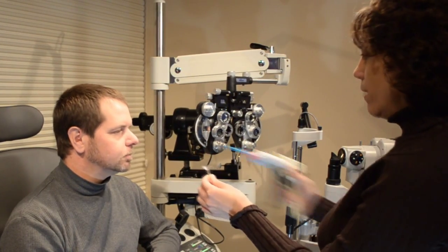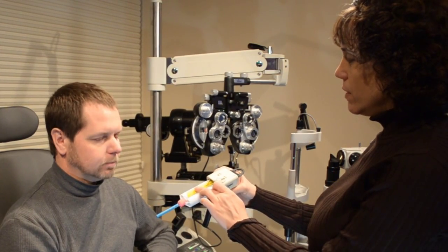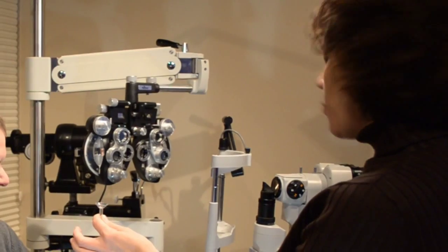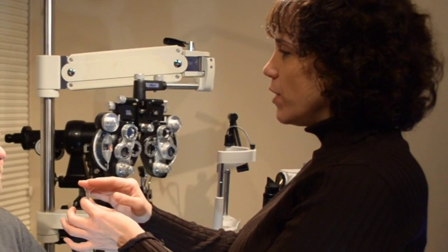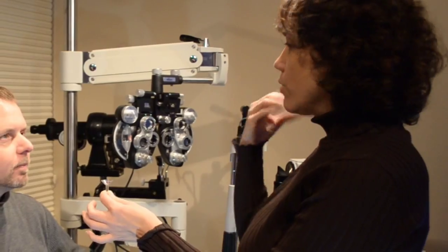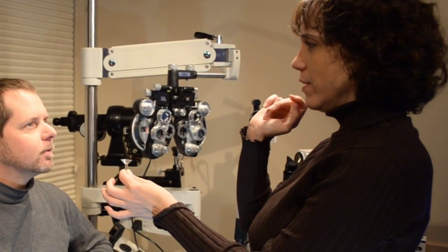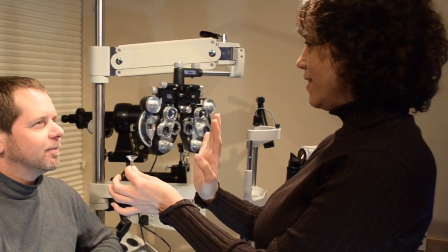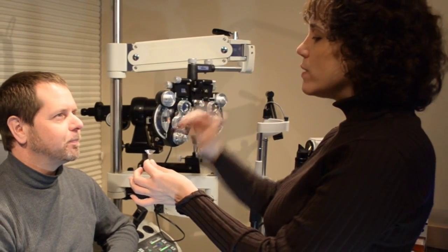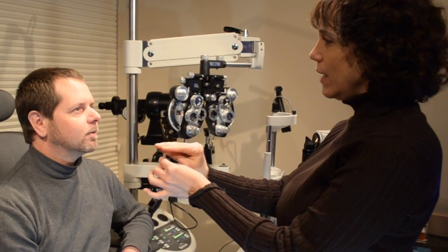What I do is I have this caulking gun here. This is some impression material that's in this gun. We fill up the tray with this gun here. When I insert this into your eye, the impression material is going to kind of flow out onto your face. It's going to feel cool and I'm going to have you just lie back and just stare at a spot on the ceiling. If it's very uncomfortable, you need to let me know and we'll help you get through it. But once the impression tray goes in your eye, it has to be in there for a whole minute to set up — I can't take it out sooner than that.